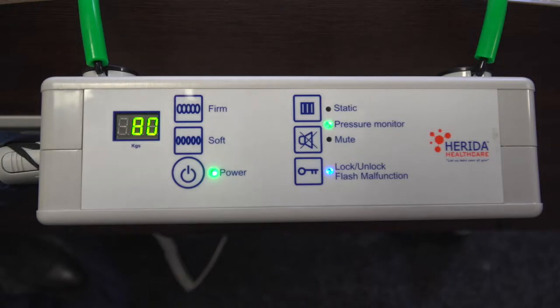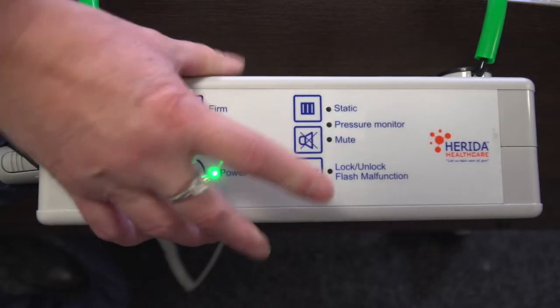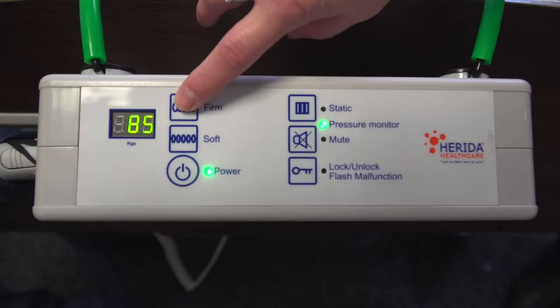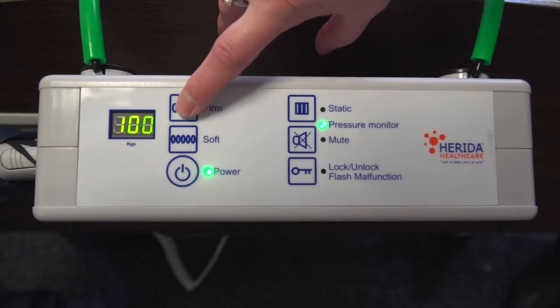To unlock the pump, hold down the lock/unlock button for 3 seconds. The pump will sound a short beep and the blue LED light will go off once unlocked. If the patient's weight is greater than 80kg, you may need to increase the pressure by pressing the firm button. Pressing this button once will increase the pressure in increments of 5kg.